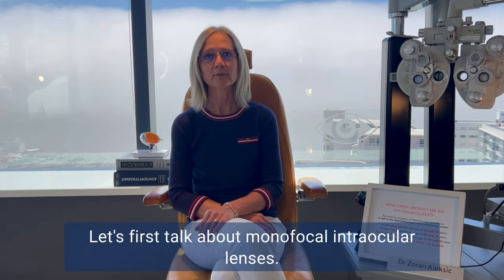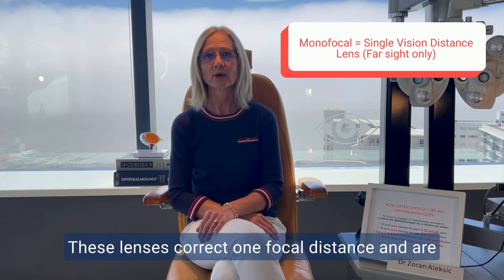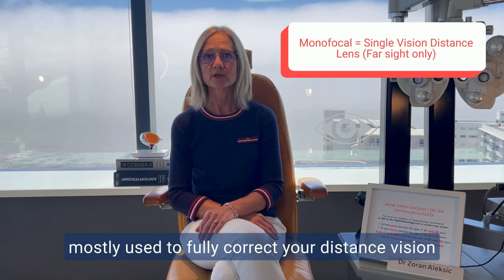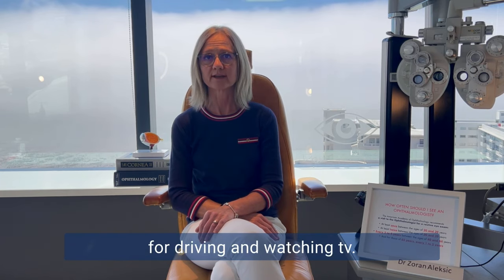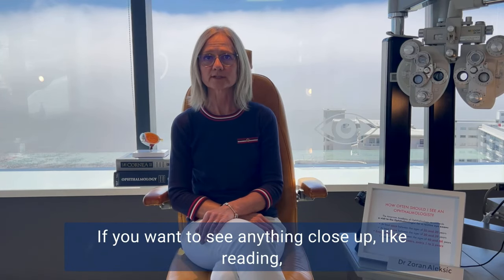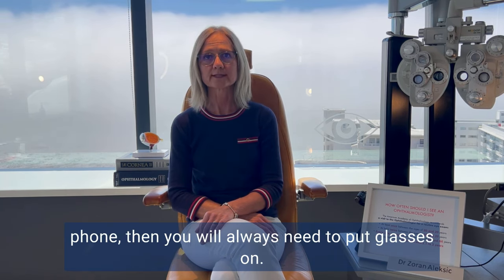Let's first talk about monofocal intraocular lenses. These lenses correct one focal distance and are mostly used to fully correct your distance vision so that you are less dependent on glasses for driving and watching TV. If you want to see anything closer, like reading, working on the computer or laptop, looking at your cell phone, then you will always need to put glasses on.